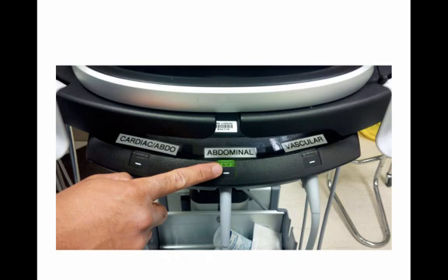So let's move on to the actual technique in performing a sonographic cardiac exam. First, let's get our machine ready by selecting our probe on the triple connect system of the Sonosite. Please note that as you begin your training, you may find that the curvilinear probe is easier to use. The curvilinear probe is actually marked abdominal on the triple connect system.